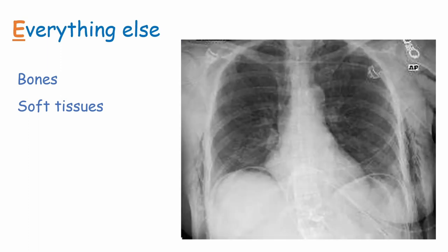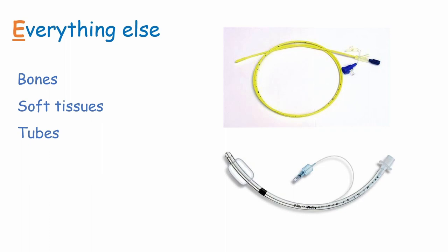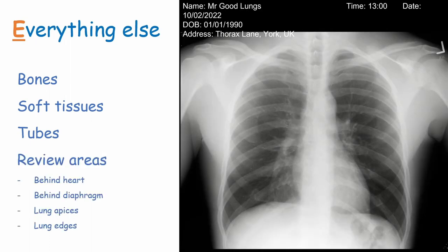To finish off our chest X-ray interpretation, we also need to check everything else. This includes bones for any fractures, soft tissues for things like surgical emphysema (which is air in the soft tissue), tubes such as nasogastric tubes or endotracheal tubes, and finally review areas. Review areas are a reminder to check the lung field behind the heart and diaphragm, and also to double check the lung apices and edges.